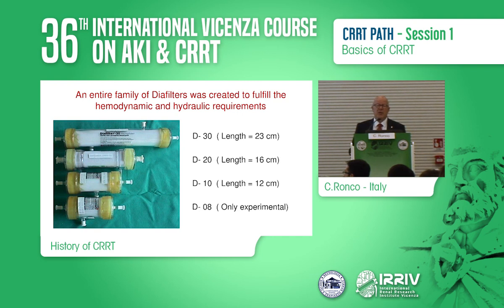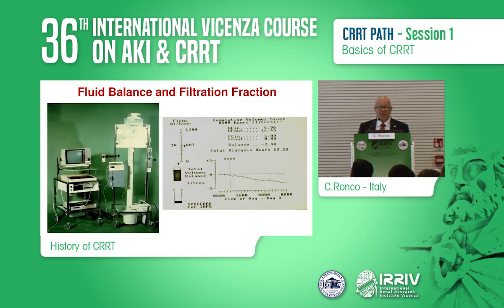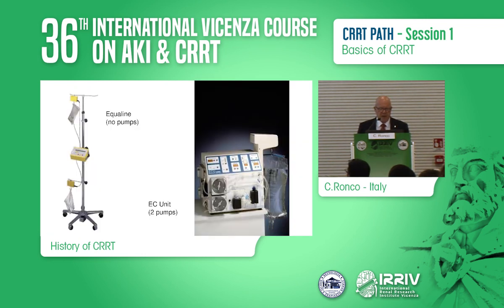So we developed a series of different prototypes and filters that were used in different patients depending on different blood pressures and the possibility to achieve different blood flows in the extracorporeal circuit. Also, flat dialyzers were designed for arteriovenous hemofiltration. This was called a simple method for fluid balance. You can see from the computer how old I am. And of course, anyway, this was a way to collect information.